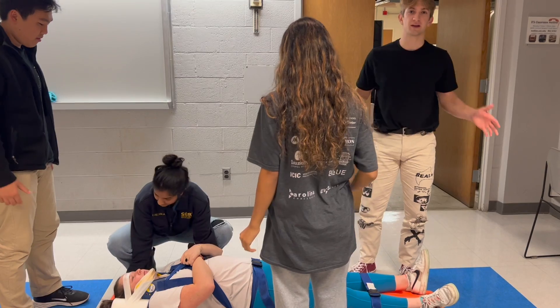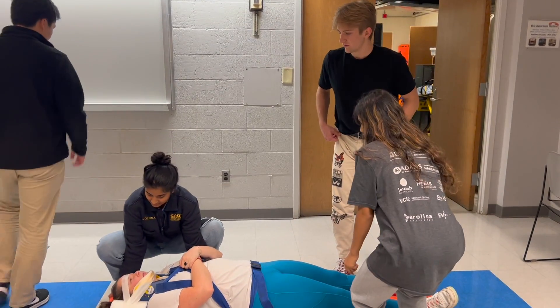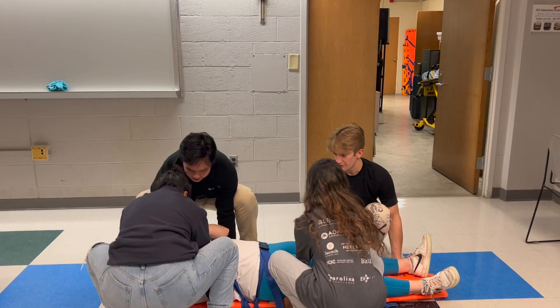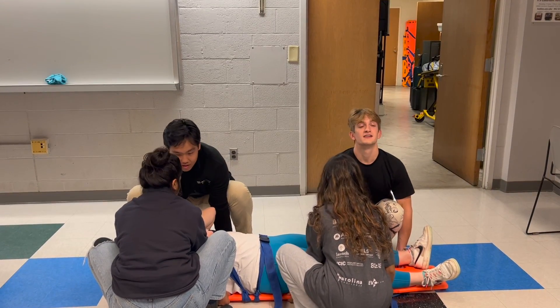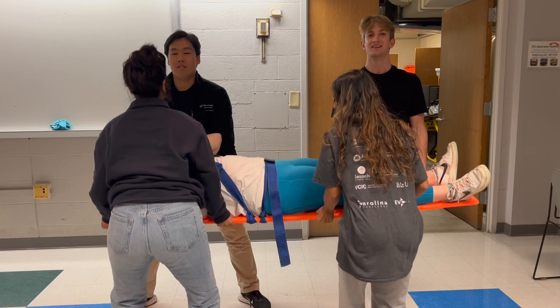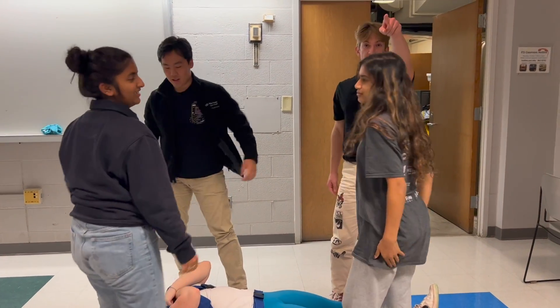We will place ourselves on the four quarters of the board. Up on three — one, two, three. One, two, three. Lift with your legs.